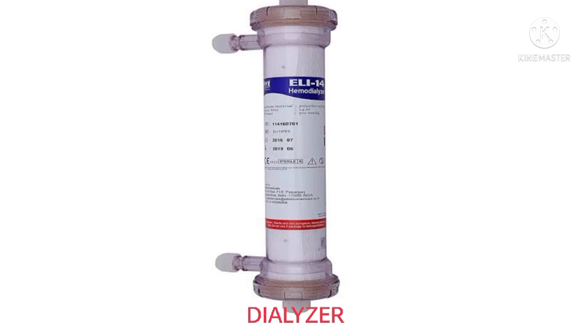A plastic chamber contains bundles of capillary tubes through which blood circulates, while dialysis solution travels outside the bundle in the opposite, counter-current direction. Diffusion and ultrafiltration happen here. Membranes used in the dialyzer: cellulose, substituted cellulose, cellulose acetate, synthetic cellulose/hemophan, synthetics, polyacrylonitrile, polysulfone, polymethyl methacrylate.